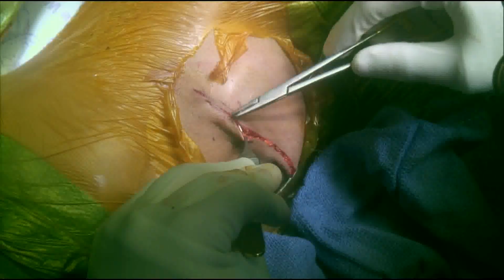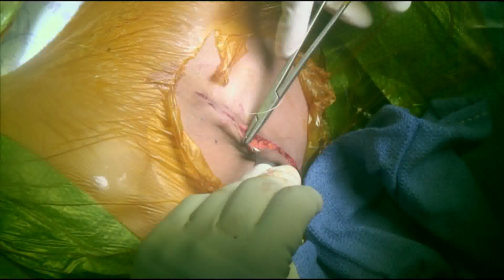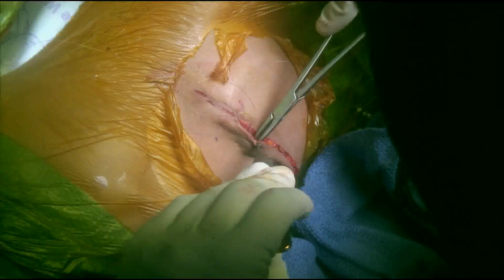The neurologist can also monitor the patient in the post-operative period in order to check for spasticity improvement and overall response to the set dosing and frequency. This can then be increased or decreased depending on the response as guided by the neurologist.